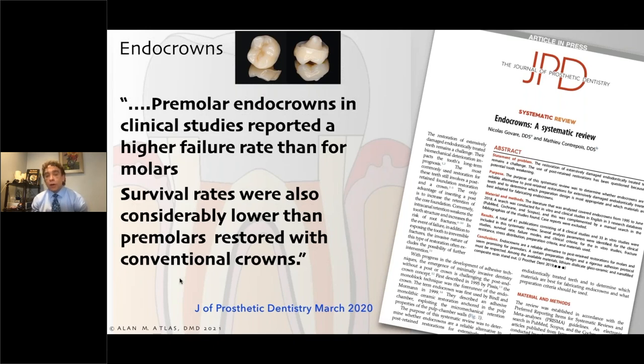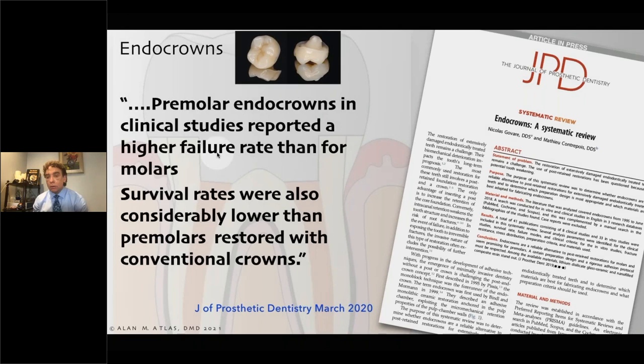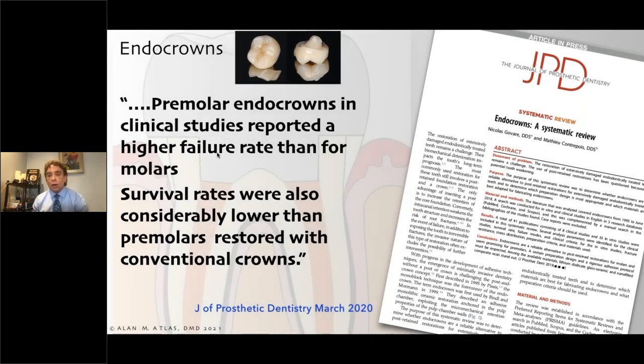Well, what happens if you have a failure of the crown? What happens if the crown chips and cracks? Getting this out is not going to be easy. It's going to be a miserable day in the office. So I never like to set myself up for a failure long term, when I know that these crowns will not last forever. And when it does have to be replaced, I want to be able to replace it easily. Endocrowns, in my estimation, do not make it easy to retreat anything.